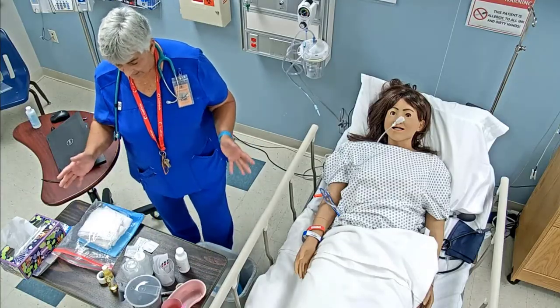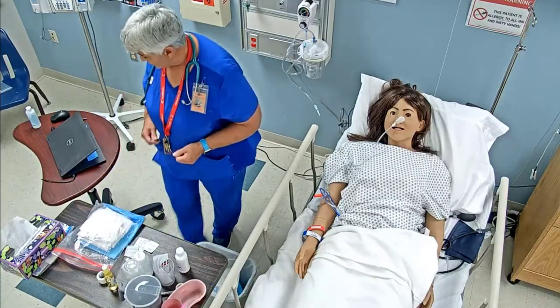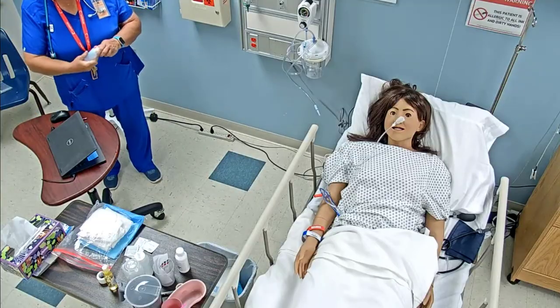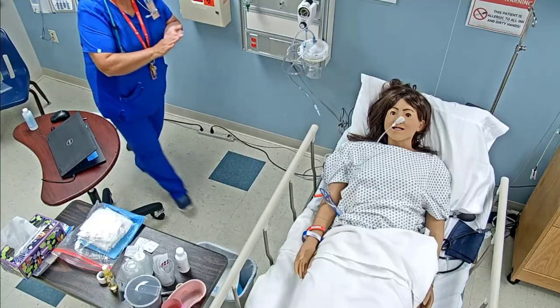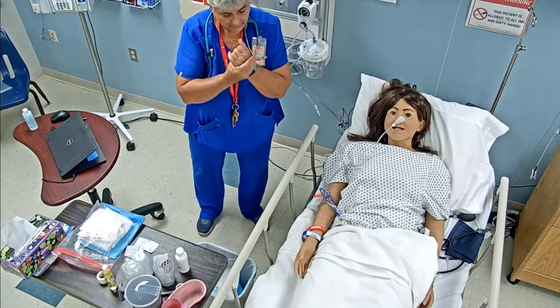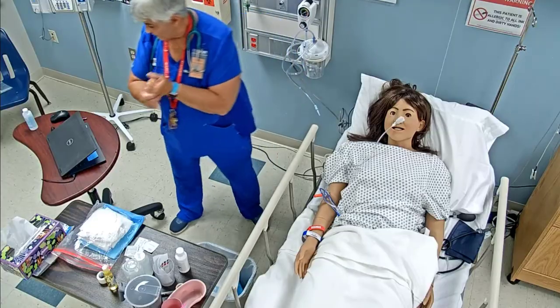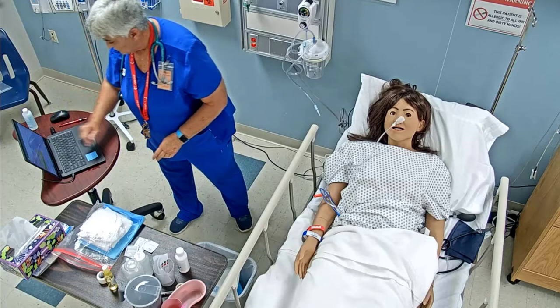And so once I've gathered all of my supplies, then I'm going to go ahead and go to the patient's room and knock on the door. Come in. Good morning. My name is Jan Buckskemper. I'm a registered nurse, and we're here to take that NG tube out. I know you're ready to do that. So let me go ahead and pull up my computer.